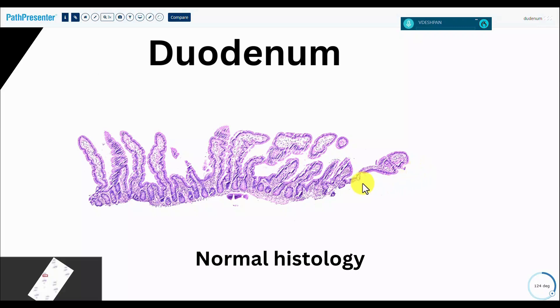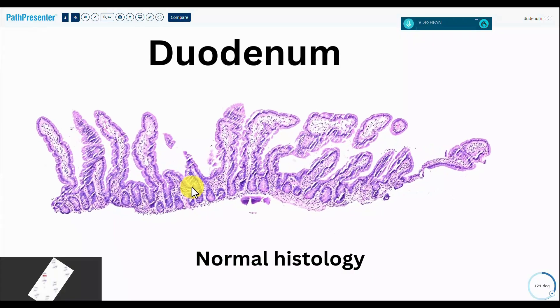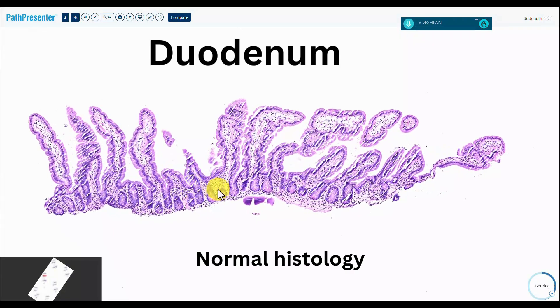We're talking about normal histology, and this is a perfectly oriented piece of duodenum — you seldom get it oriented like this. Let's look at the various parts.